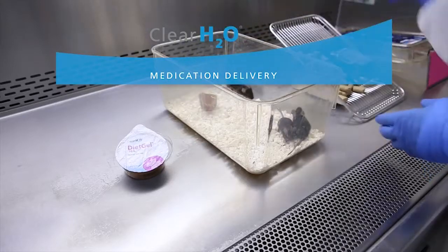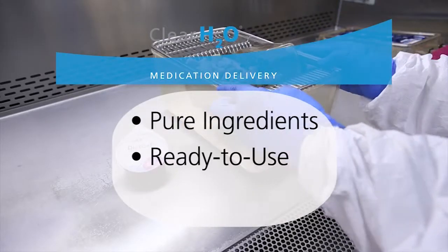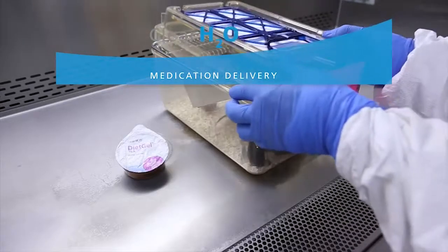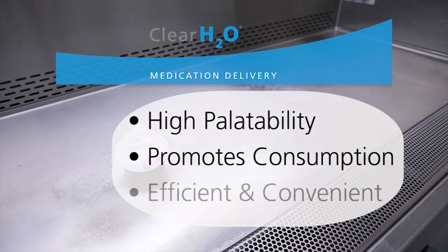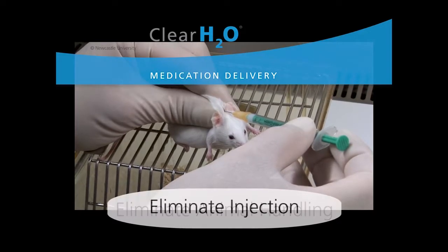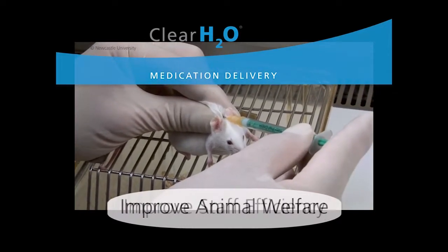These flavor-enhanced gels are made with pure ingredients and ready to use for mixing in the desired medication for oral delivery. The high palatability of these gels promotes consumption with recovering rodents, delivering medication in an efficient and convenient manner, eliminating the need for animal handling and injection, and improving welfare and staff efficiency.